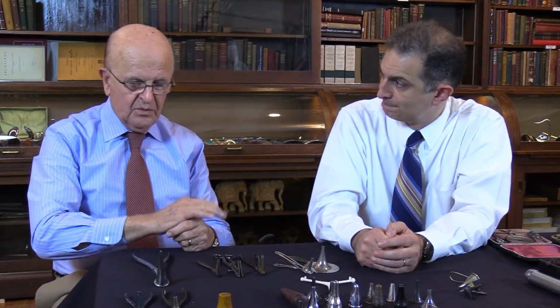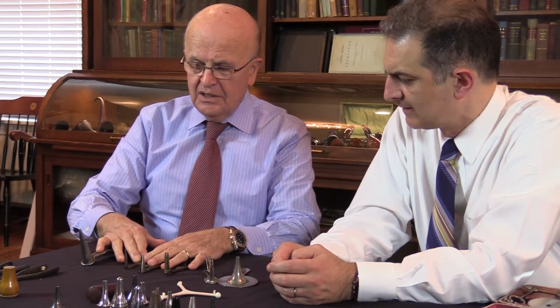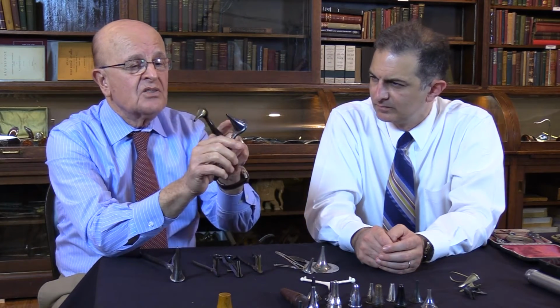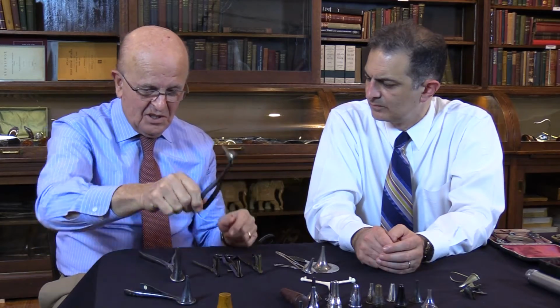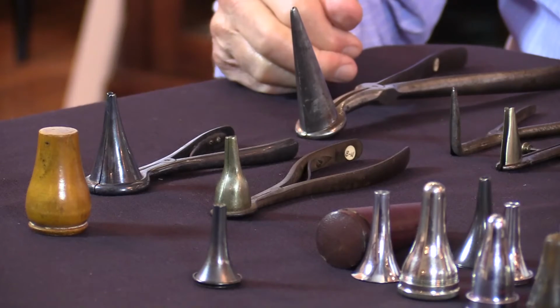Well, but the person that revived these old original bivalves is Kramer in Germany. Kramer used to be a very famous otologist. He was the leader for about 50 years, and he had the Kramer's ear speculum. And as you can see, some of the Kramers have the Hartmann type of ear speculum, and the other one has the Earhart ear speculum, where it comes straight and then it opens. So these are the bivalve, a very important stage of developing an otoscope.